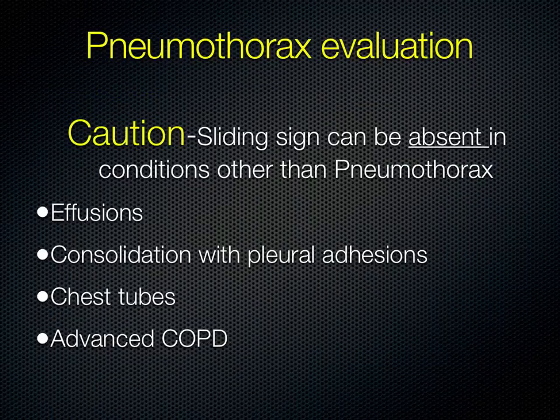So a couple caveats. Sliding sign can be absent in conditions other than pneumothorax. Anything which would not allow the visceral and parietal pleura interface to move against each other easily can cause lack of sliding. However, if you do the Sky Ocean Beach M-mode, you should still be able to appreciate Sky Ocean Beach in a patient who does not have a pneumothorax.